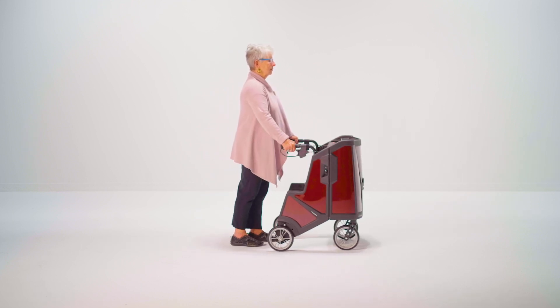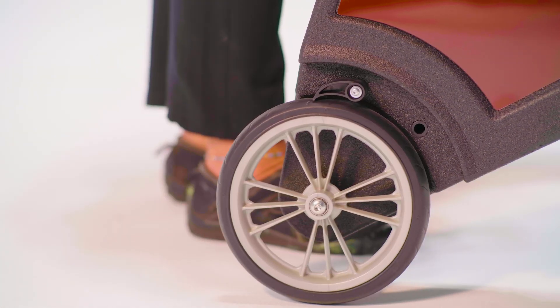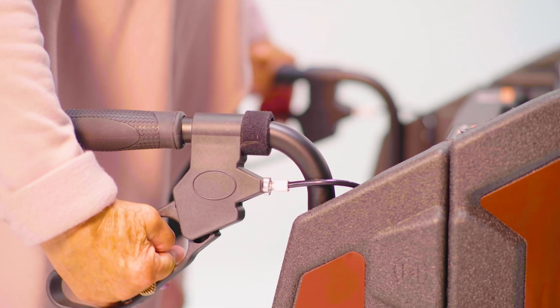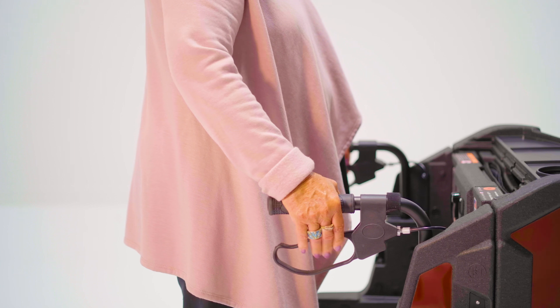When functioning properly, the brakes should stop your rear wheels when squeezed like this. They should also lock the rear wheels as a parking brake — for when you're using the seat or other needs — by pressing down on the brake until you hear and feel a click. You release the parking brake by squeezing the handle like this.